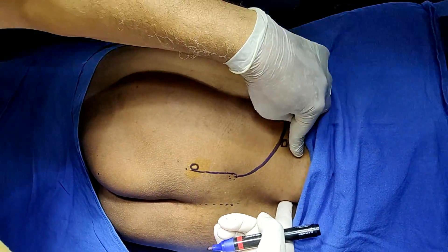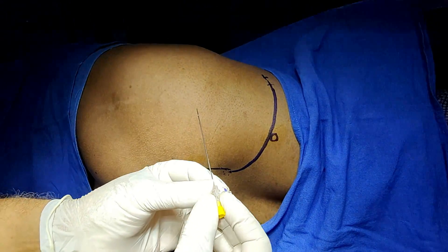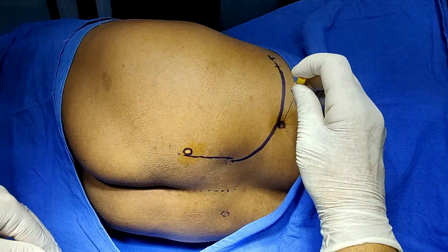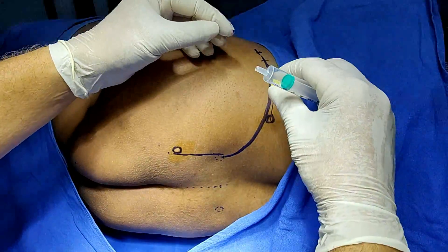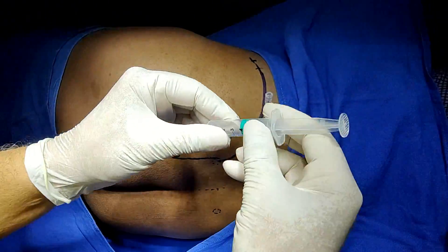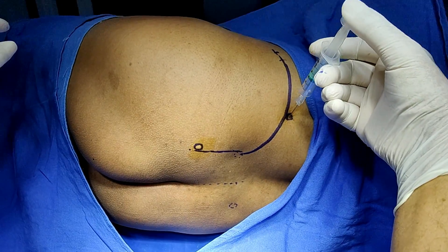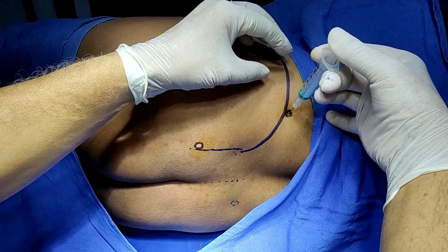This is the back muscles here. Insert the needle five to ten degrees medially. You will have a giveaway feeling in a superficial plane — don't inject it there. Just insert it past the stringy sensation of the muscles and go further.